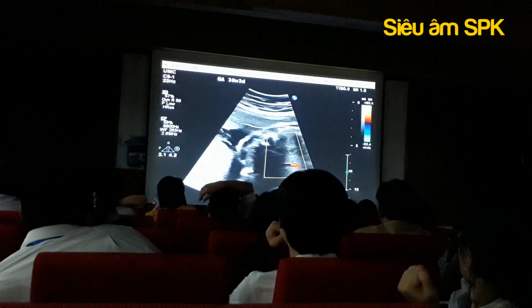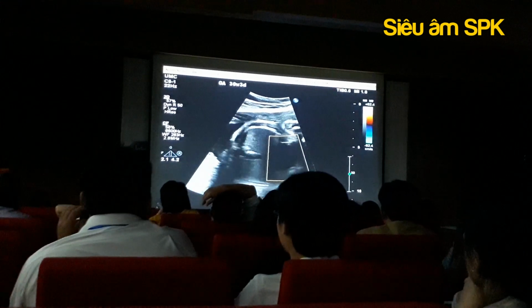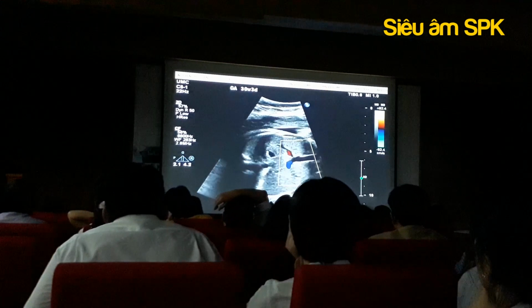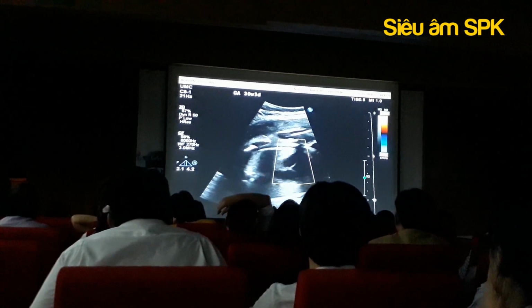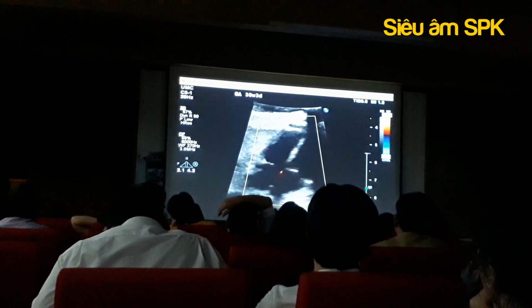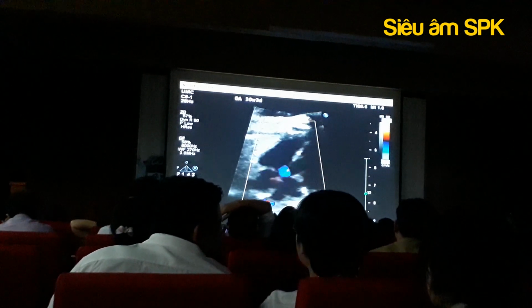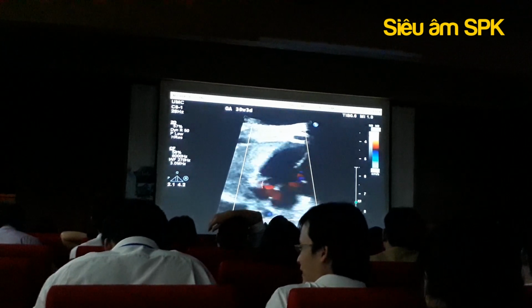We'll do more Dopplers tomorrow. So that's better. Two separate inflows, no significant regurgitation.